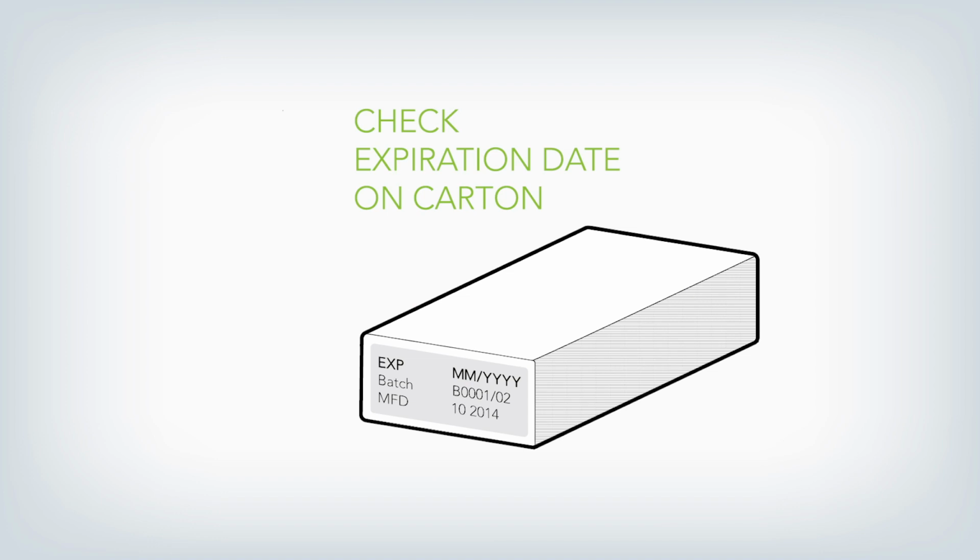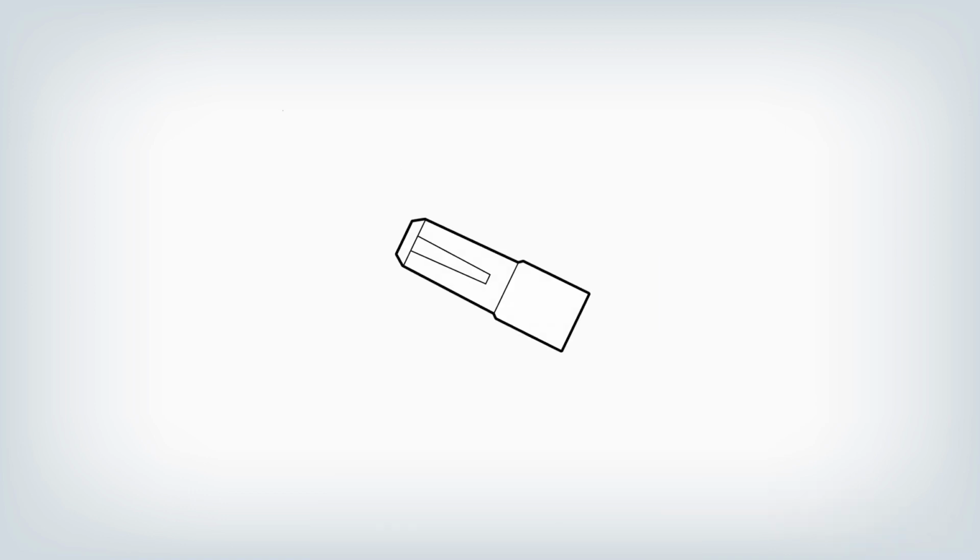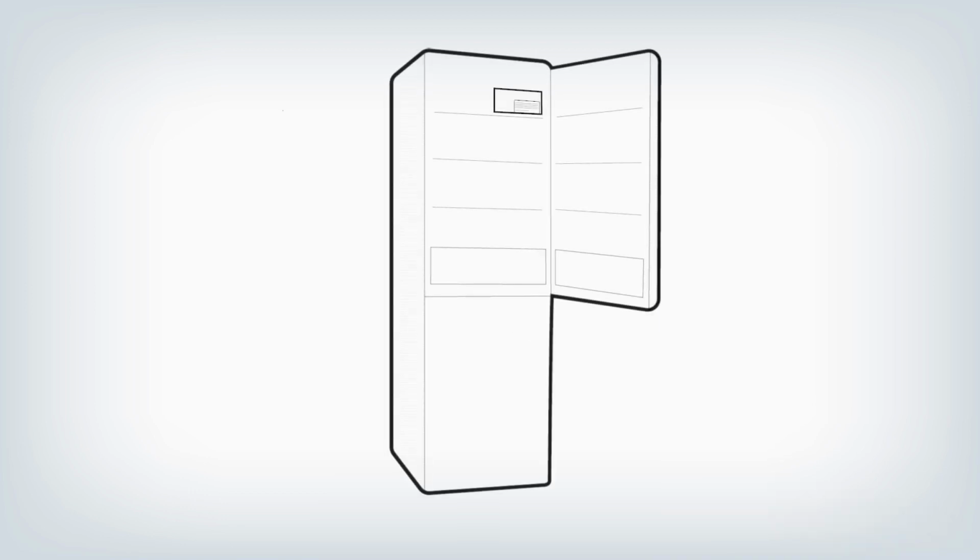Check the expiration date printed on the carton. Take a single-use prefilled syringe out of the carton by holding the middle part of the syringe. Do not use if the expiration date has passed because the medicine may not be safe to use. Do not remove the cap until you are ready to inject. Put any remaining prefilled syringes back in the refrigerator.